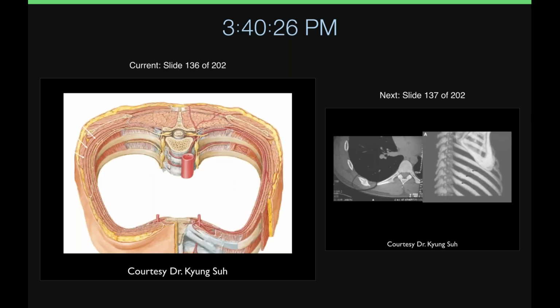When is MR indicated for them? Well, MR typically is indicated in athletes where the problem is usually tears of the muscles, usually the obliques. And often we do the MR for the muscle tears because CT and even ultrasound aren't very good for those. And sometimes we'll see the muscles are okay, but we'll see edema within the ribs, which would be the stress fracture in the ribs.